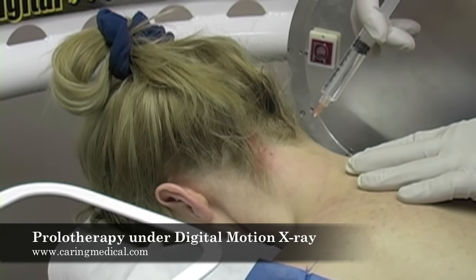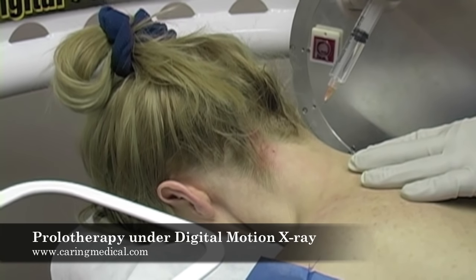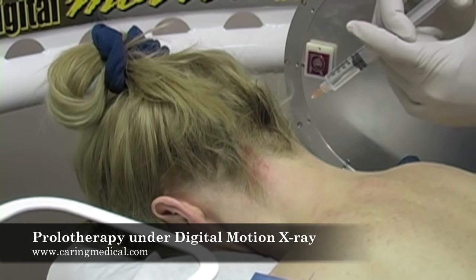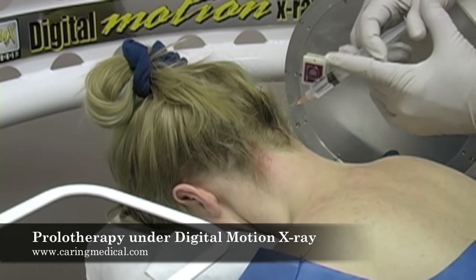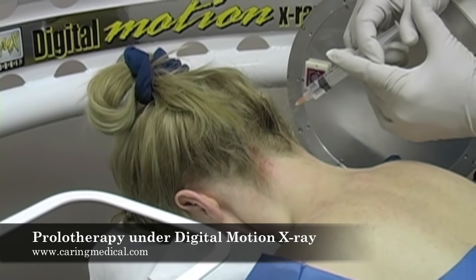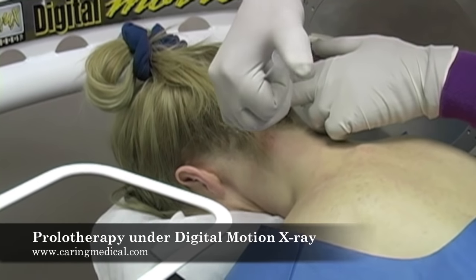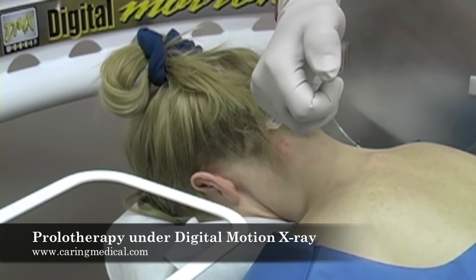This particular patient, besides vertigo, tinnitus, and suboccipital and migraine headaches, is also suffering from scalp tingling, racing heart, labored breathing, jaw pain, and a host of other autonomic nervous system problems stemming from her cervical instability. She's had great resolution of many of her symptoms from prolotherapy — especially prolotherapy done under fluoroscopy, which allows me to aggressively treat the C1 area.